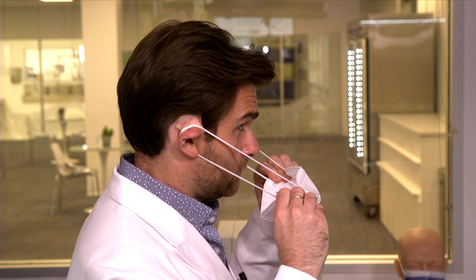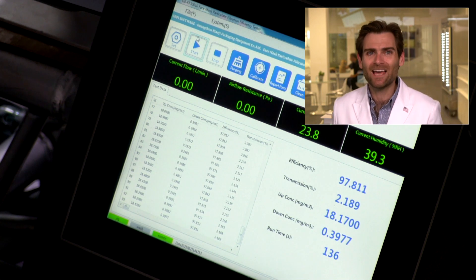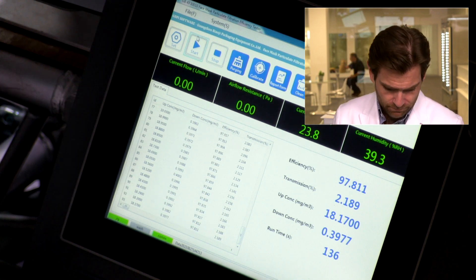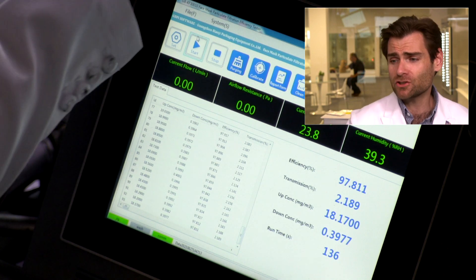I don't love that the ear loops might actually fall off on your face — let's test it. Okay, they don't fall off, so that's good. But does any of that matter if it doesn't protect you? PFE results are in: 97.811%. Hey, they're meeting their standard — good job Daily Protective, Prim Care.